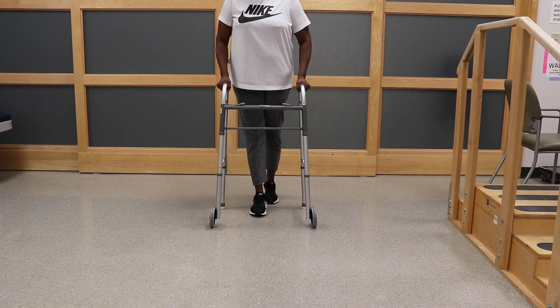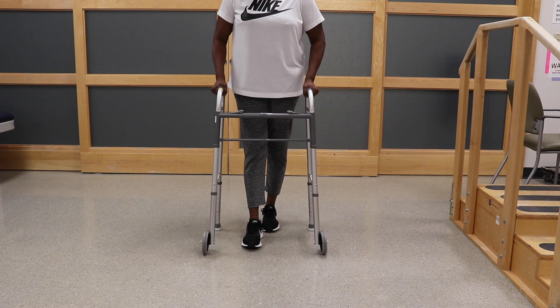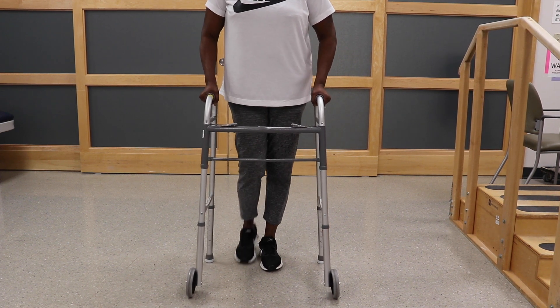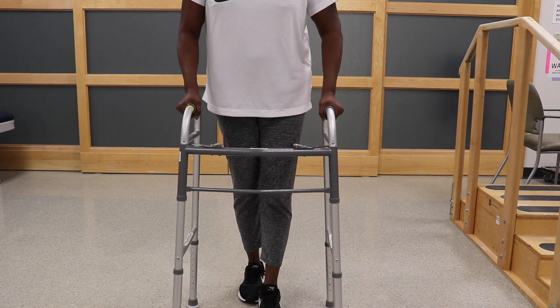After surgery, you will use a walker. If you do not have access to a walker, we will provide one for you and bill your insurance. Most insurances pay for one walker every five years.